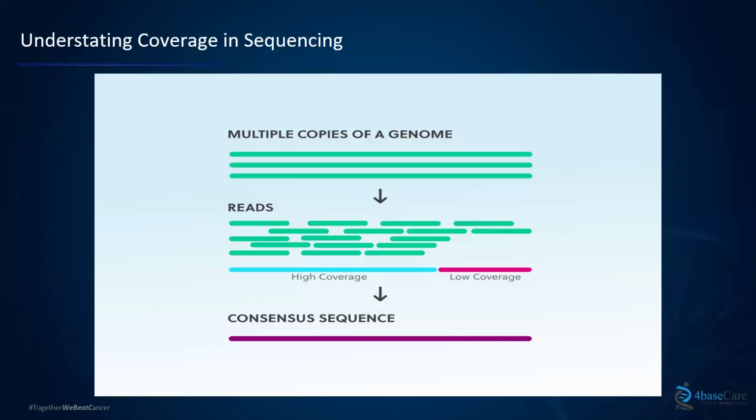So this is one important information for all of us. All people talk about depth of coverage. So I told you about the consensus reference sequence, right? This is your patient's data, many different fragments of DNA. So you have to see how many times you read this reference region on your patient sample, that much confidence you are building.